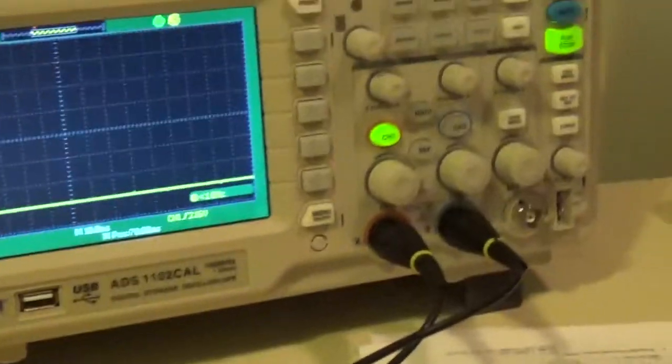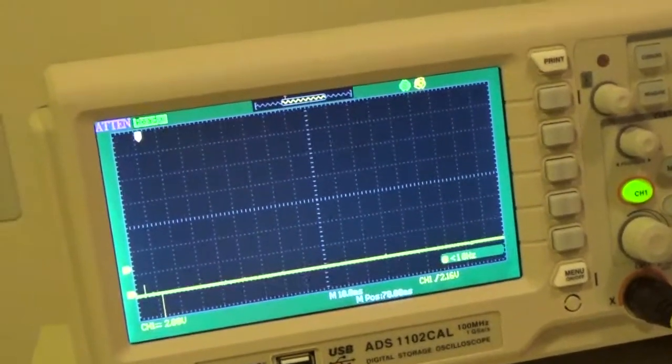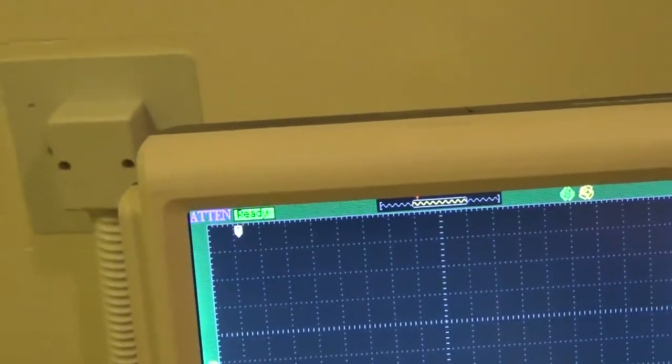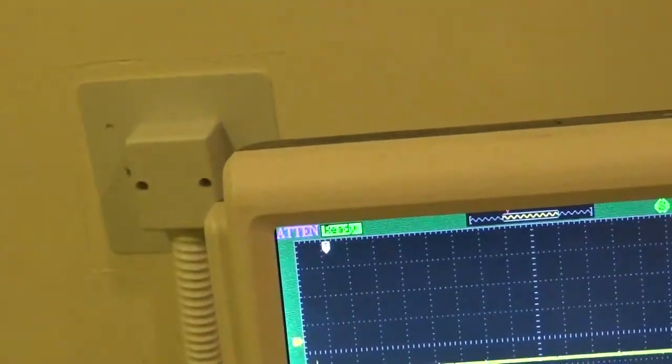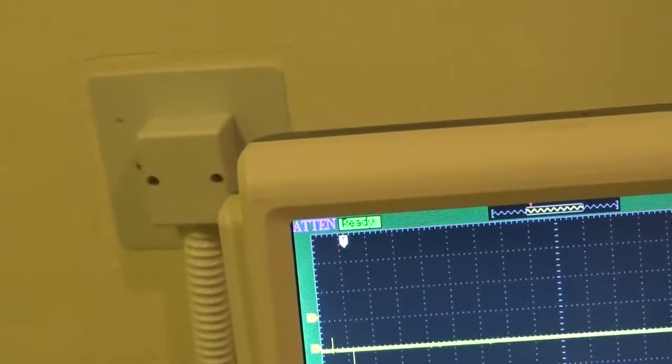So the first thing that I'm going to do, I purposely put this first channel on the anode because anode is positive going voltage with respect to the ground. So our trigger is still going to trigger off of a positive going slope because mA or anode is positive going. So we're going to move channel 1 to the center graticule, just like this. We're then going to turn on channel 2.